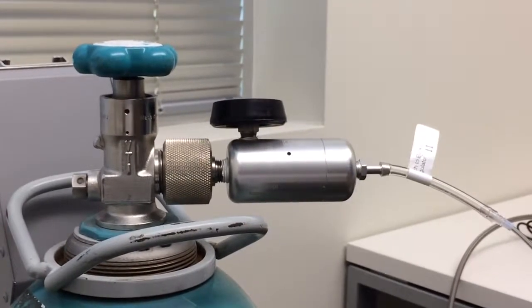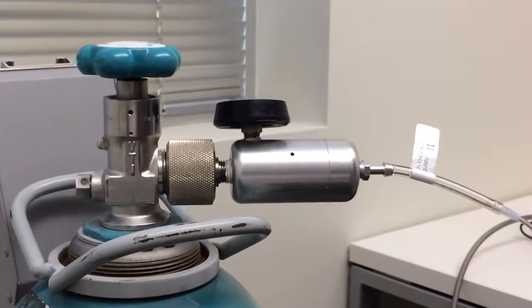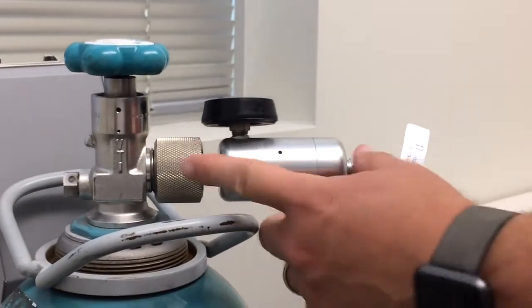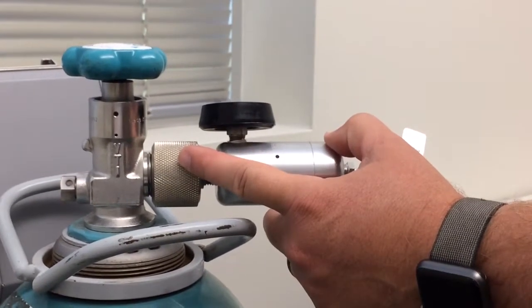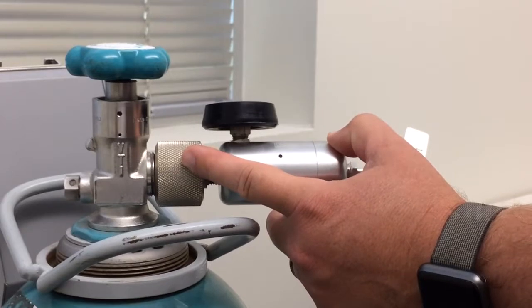So this is the backup system for the Aranox, a really simple system. We've got a preset regulator that hooks directly to the tank. It's set at 0.25 liters per minute.